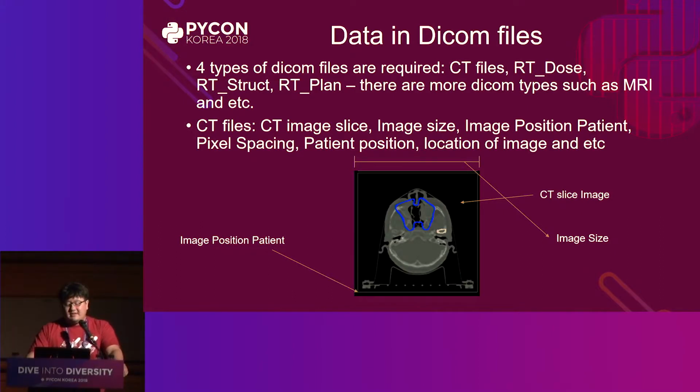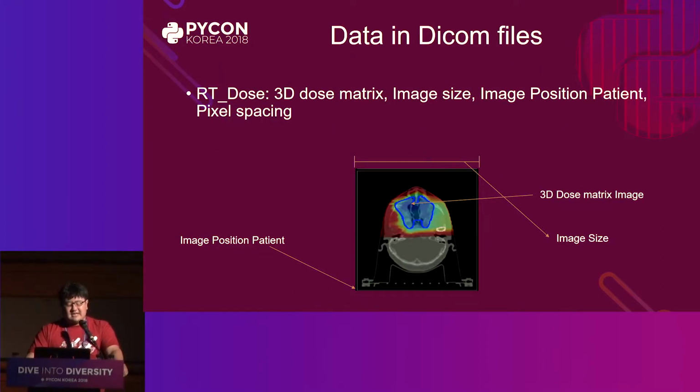Here is the dose file. It also contains the image size, the image position patient, which is the origin of the dose map, and the information of the three-dimensional dose matrix.